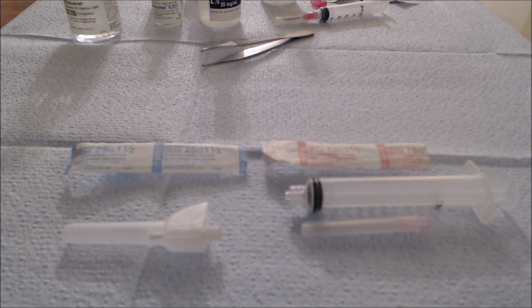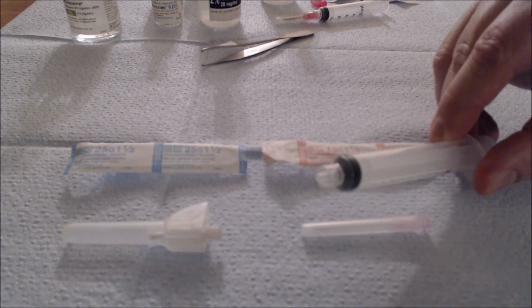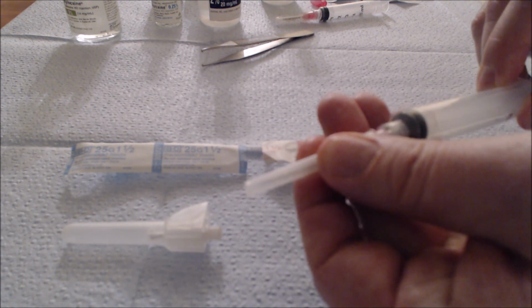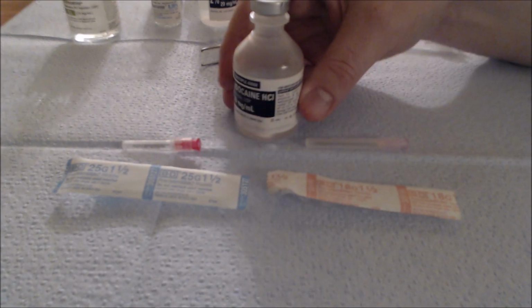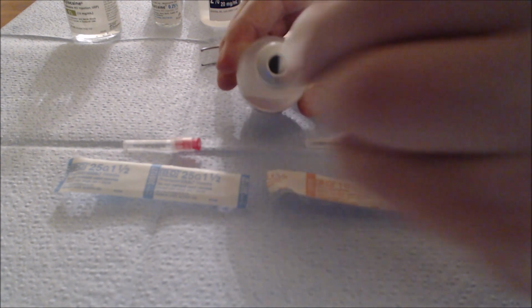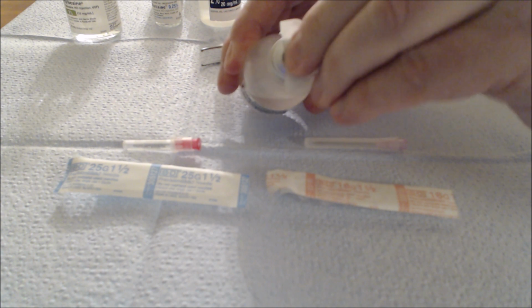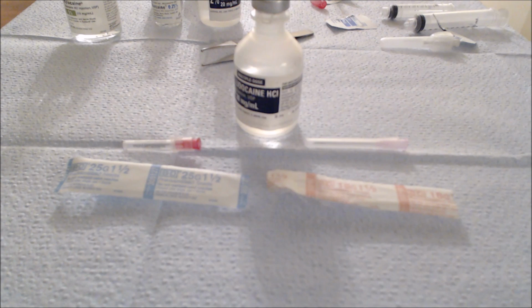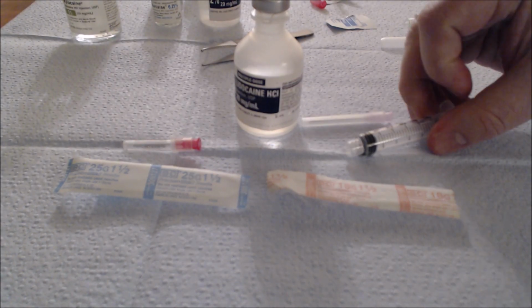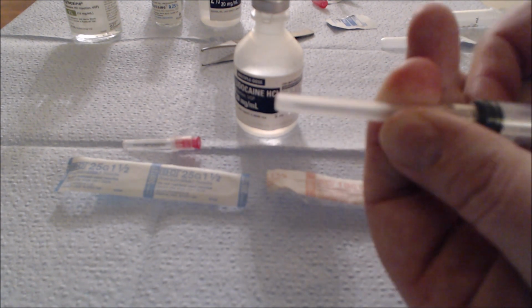by using a luer lock syringe. You'll see at the end of this syringe that there'll be a hub where the needle will hook into the syringe and keep it tight. In order to draw the medication, we'll first take our bottle and clean it with an alcohol swab. This will kill most of the bacteria on the rubber stopper. Then we'll find a syringe, a 5 or 10 cc syringe, and affix it to our 18 gauge needle.